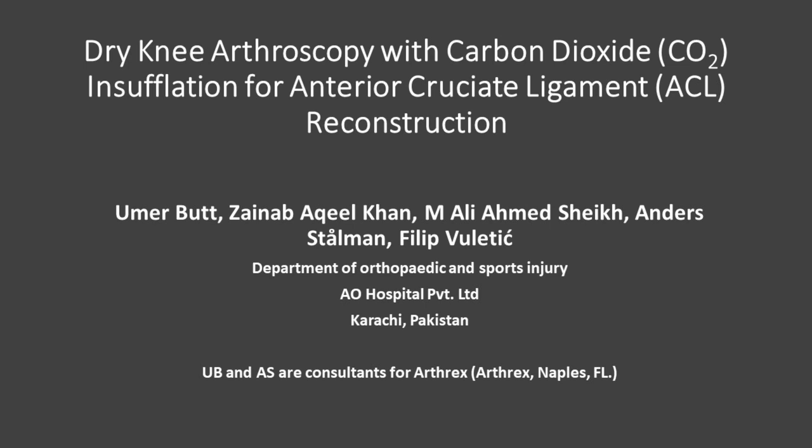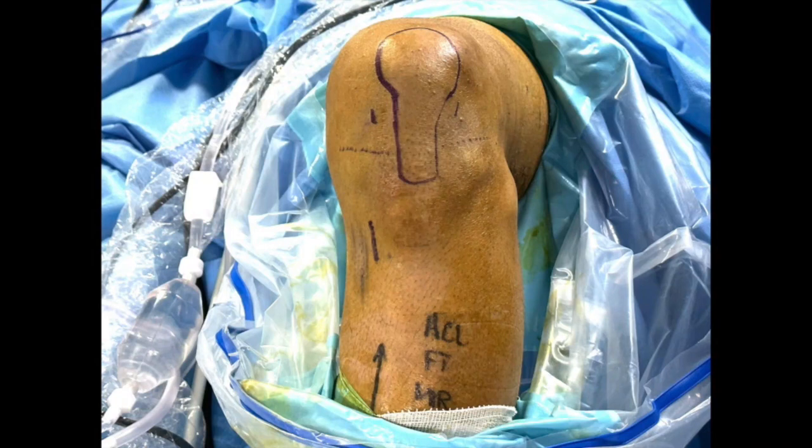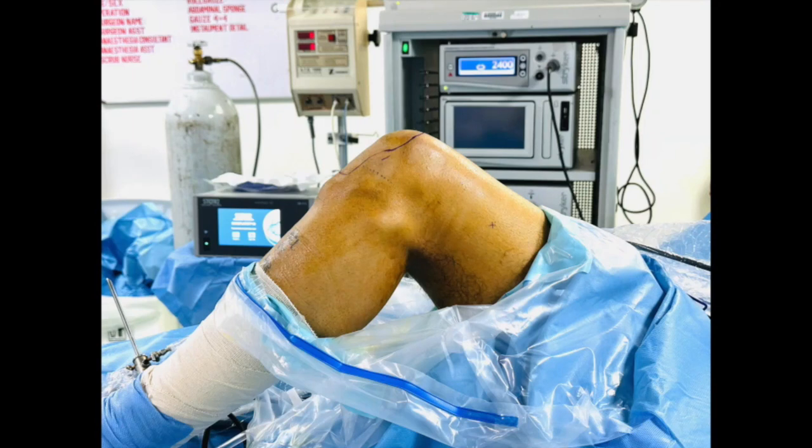The patient is supine with a standard lateral post proximal to the knee. A tourniquet is applied around the thigh, and the limb is prepared and draped in the usual manner. Anatomical landmarks are drawn, and the lower extremity is drained of blood with an Esmarch bandage. The tourniquet is then inflated to 300 millimeters of mercury.